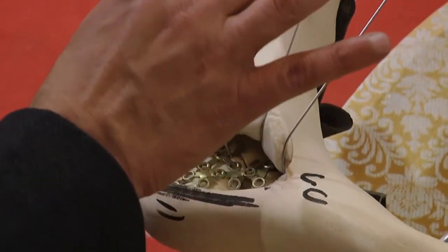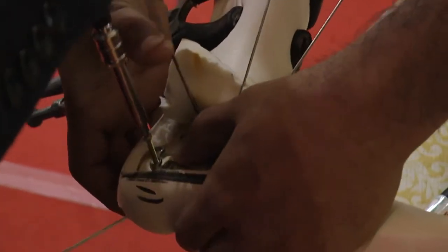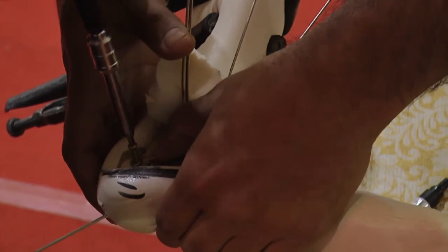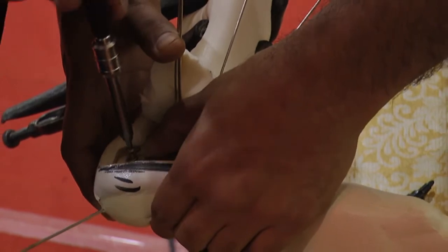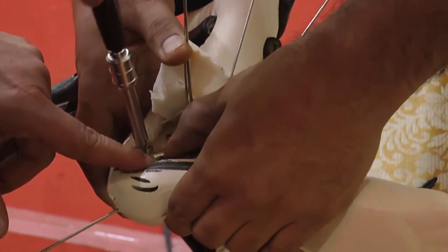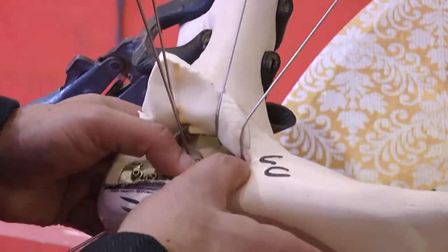Generally, I will put a screw out of the plate in the direction of this wire that we just showed. So that gives you more confidence that your lateral facet has been stabilized and will not move while you're fixing with the plate. And sometimes it's possible to put another screw, the sustentacular screw, also through the plate, which gives you a better hold because the screw head does not sink into the bone. If it is in the plate, it gives you a better purchase. So that stabilizes your plate onto the bone.